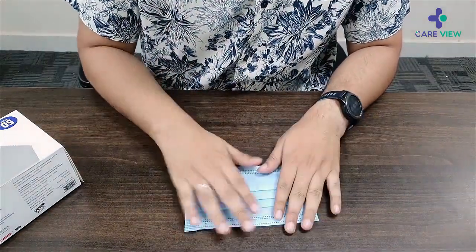It is also ultrasonically sealed from all ends. I can't wait to try this on, so let's do that. The mask is super secure and super breathable — I really liked it.